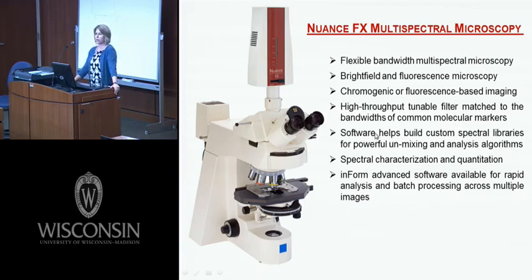The software provided with Nuance allows you to build a spectral library for each chromogen or fluorochrome that you're using, and as such will allow you to unmix the images, and by unmixing you're able to quantify downstream. And in addition to being able to utilize the Nuance software, the images that are generated from this camera can also be used in the inForm software.